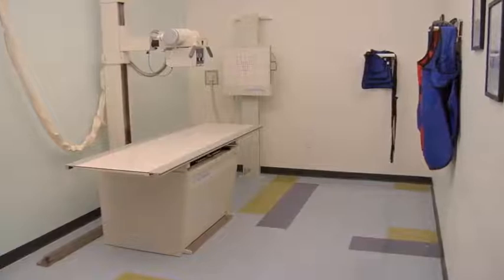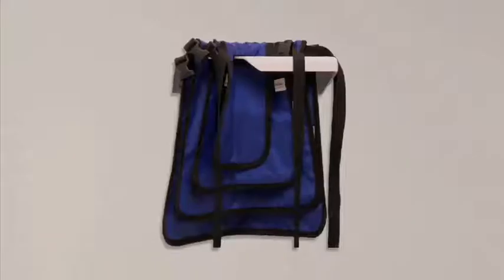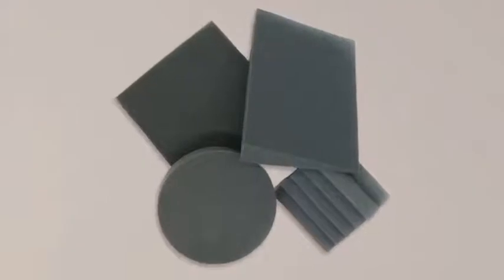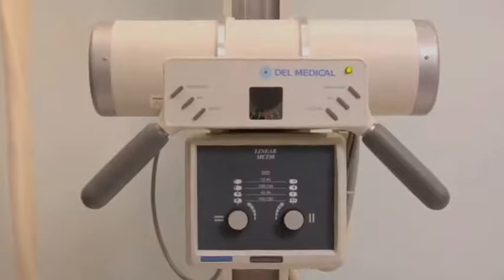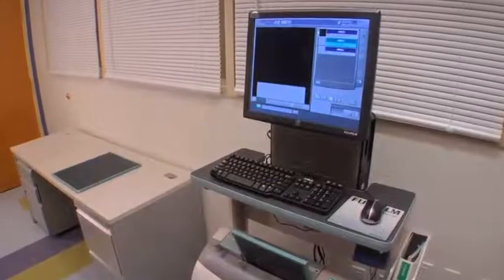Equipment required for radiographic projections of the hip and lower extremity includes an upright or table bucky, cassettes of the following sizes: 8 by 10 inch, 10 by 12 inch, and 14 by 17 inch. A protective lead shield for the patient, an assortment of lead markers, radiolucent sponges and tape to help with positioning, an X-ray generator and X-ray tube protective housing assembly, a control panel behind a protective lead line barrier, and a computer radiography system.